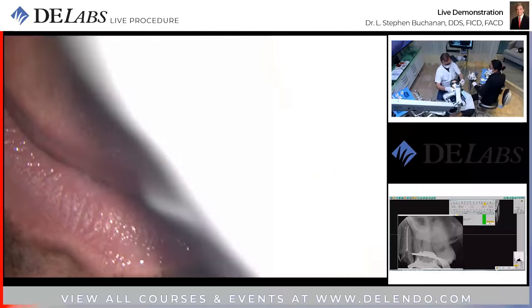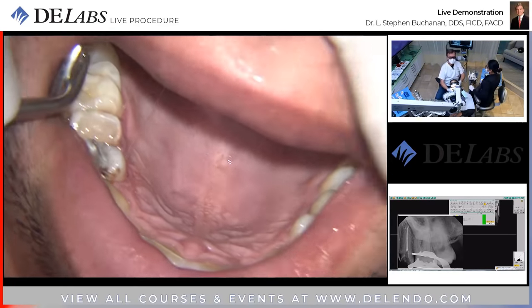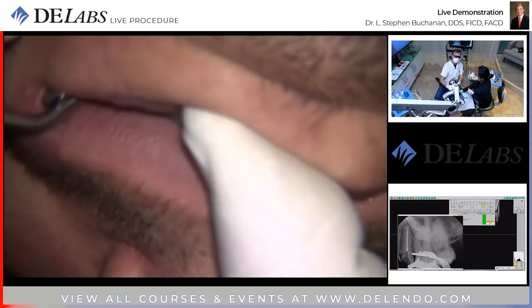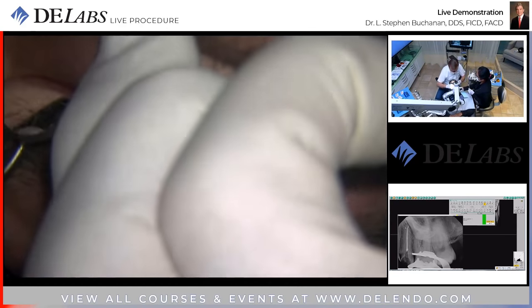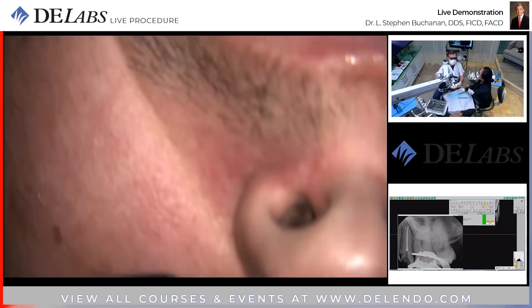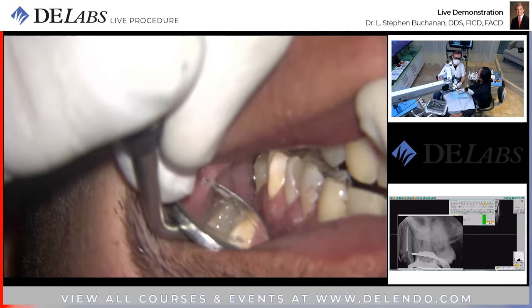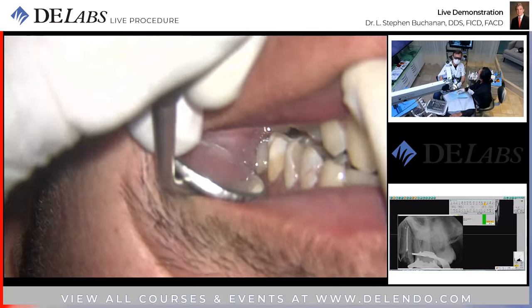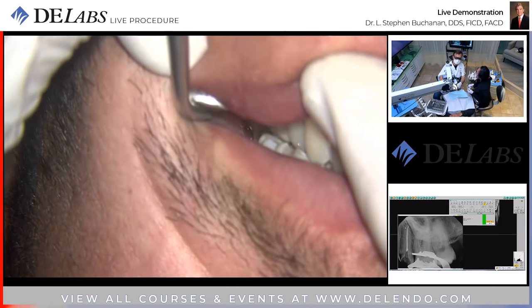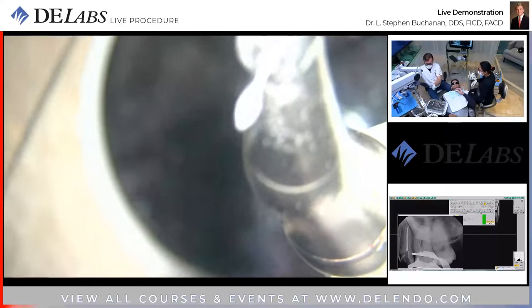Okay. Check occlusion. Turn this way. Turn to the right for me. Close your teeth together, please. I can't see in there. Okay, relax your lips just a little bit. I just need to see how your teeth are touching. Close down on your back teeth. There you go. Okay, cool. All right, let's get imaging.